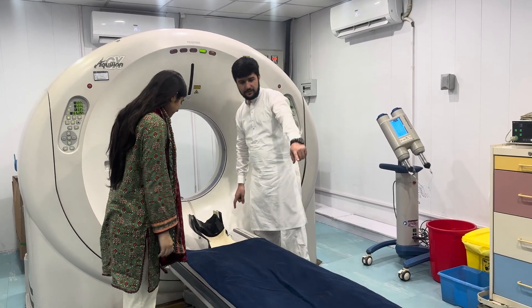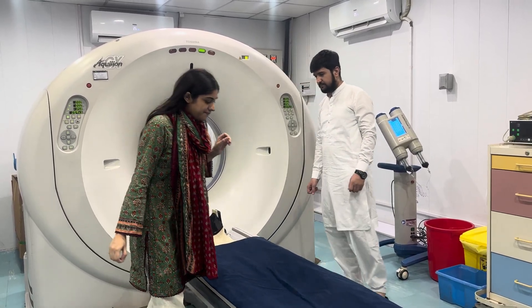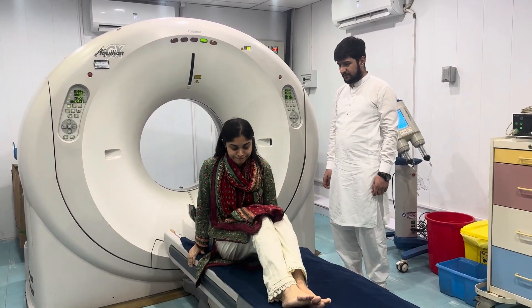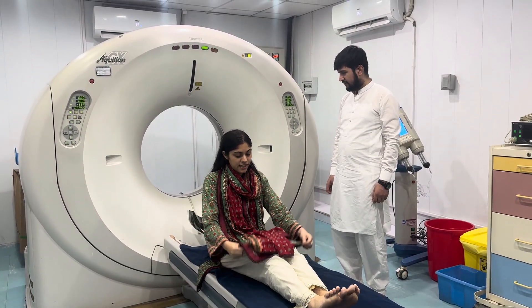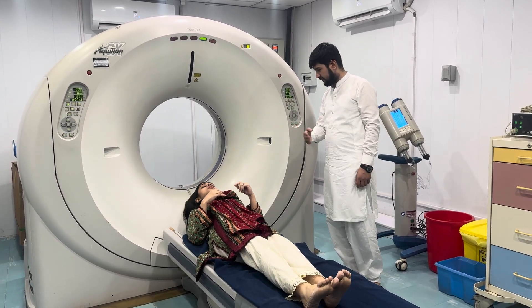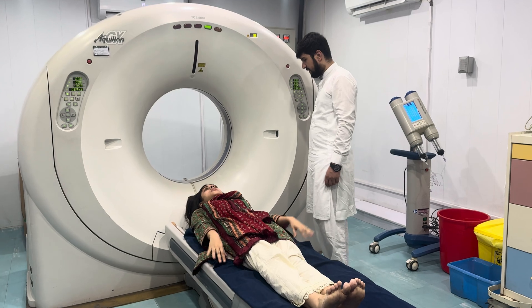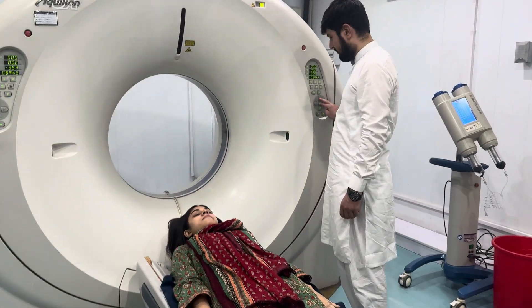Welcome to Oman Radiology Gallery. I'm glad to see you all again. In today's video we are going to explore something advanced but essential: how to generate high quality 3D images of cochlea and semicircular canals using volume data. This is essentially important for cochlear implant candidates and for pre-surgical planning.